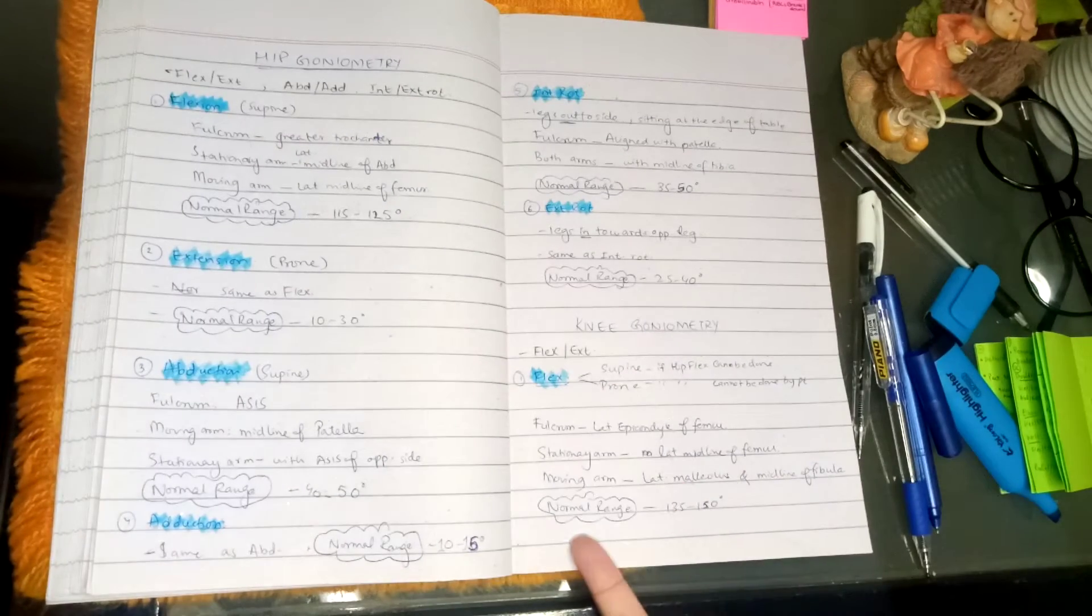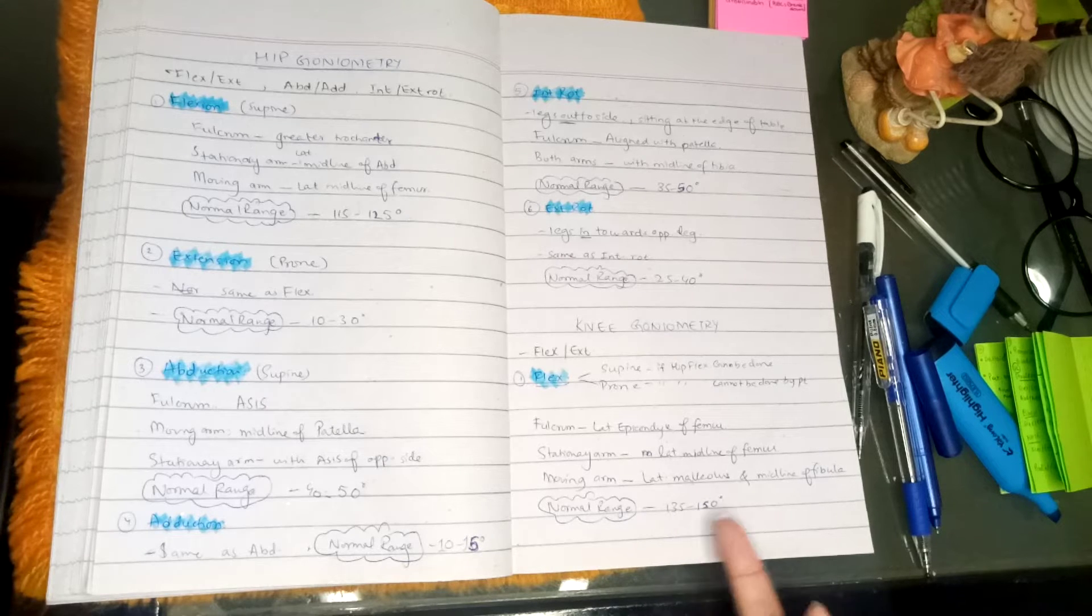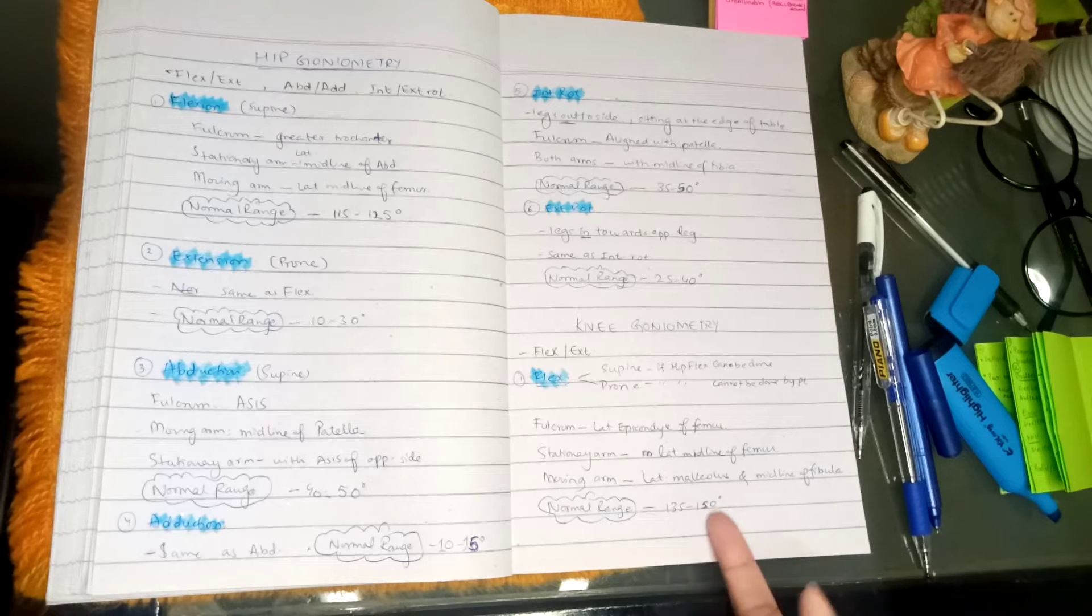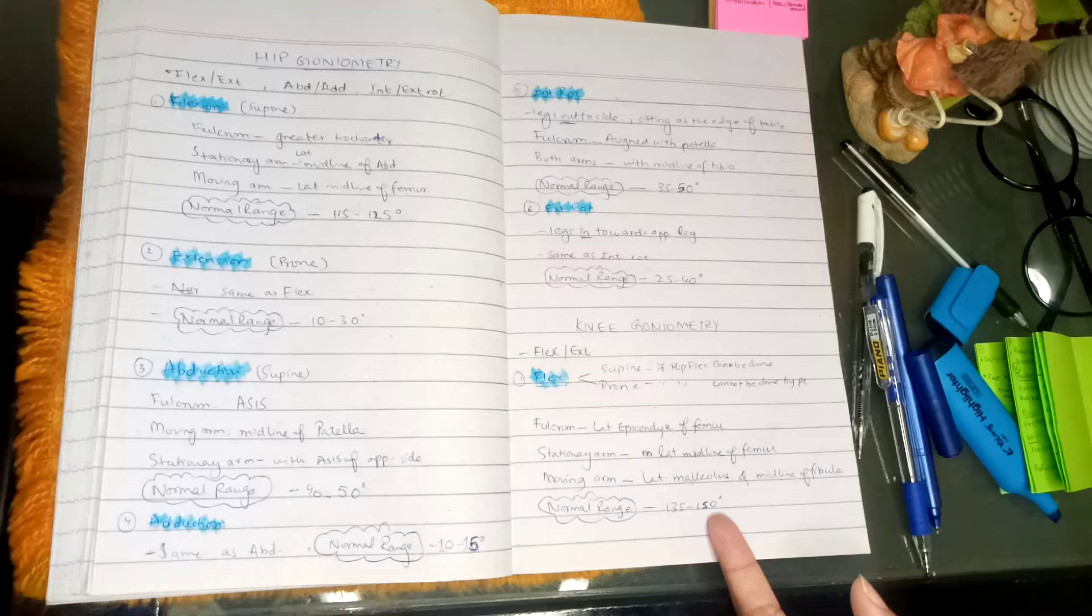We have the normal range that would be from 135 to 150 degrees, which will be knee flexion.